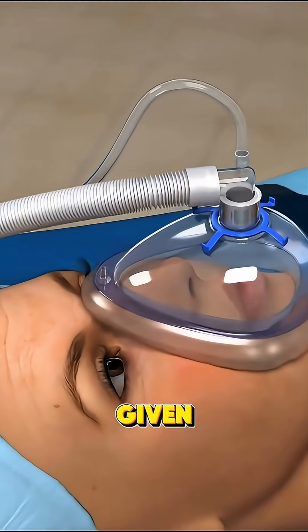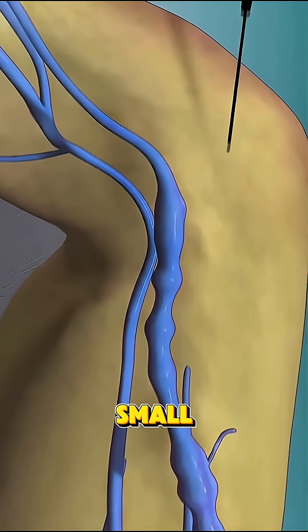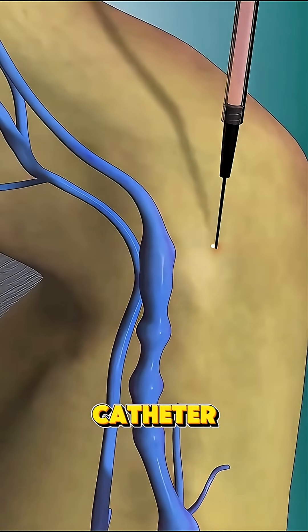First, the patient is given local anesthesia, and a tiny catheter is inserted through a small incision, usually in the groin or arm. This catheter is carefully guided through the blood vessels to the site of the blockage.